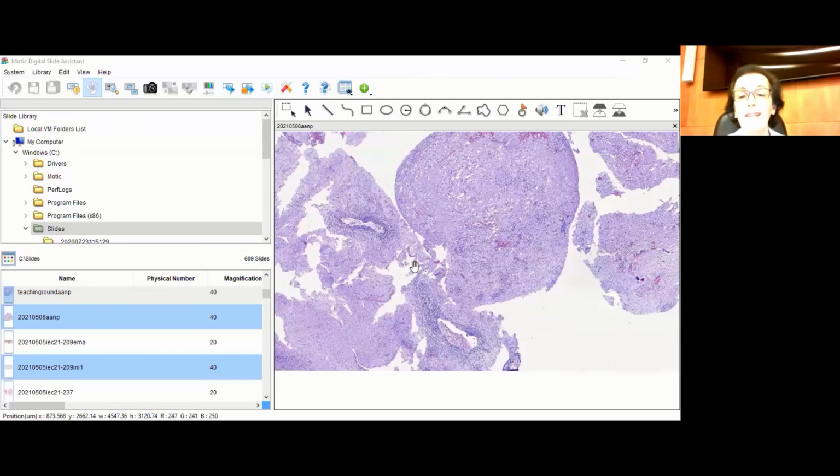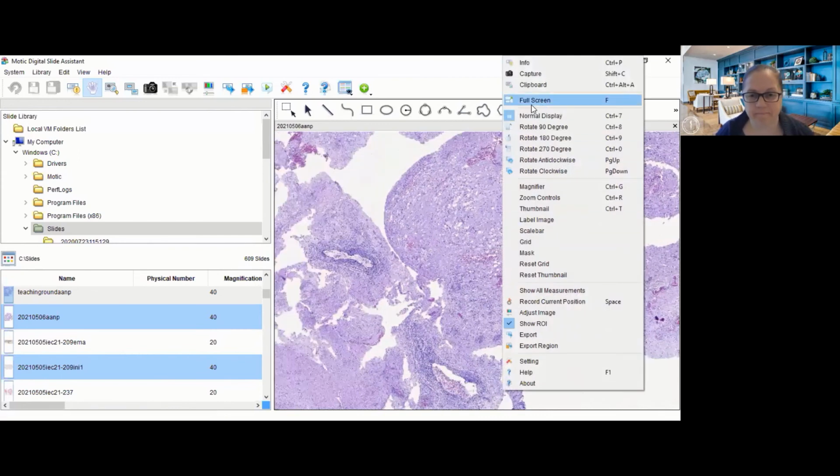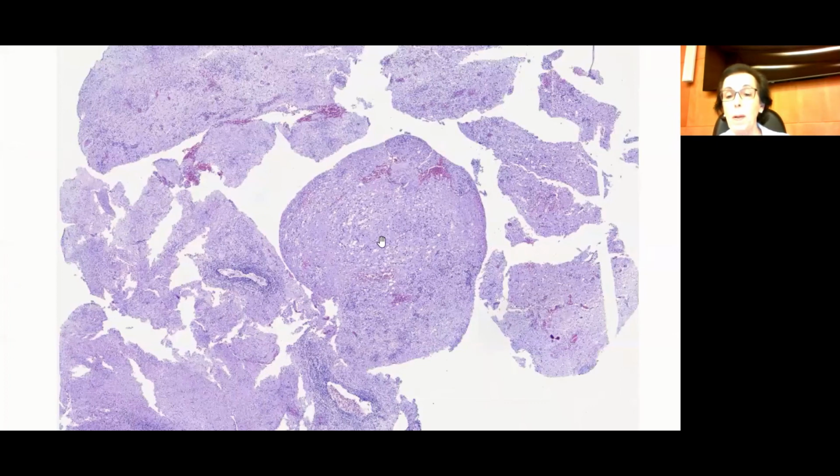Okay, do you want to share the digital slide that you had? Yes, I forgot. Just a moment, I have to share here first. Can you see it? Yes, yep, we can see it. Okay, just put it in full here.